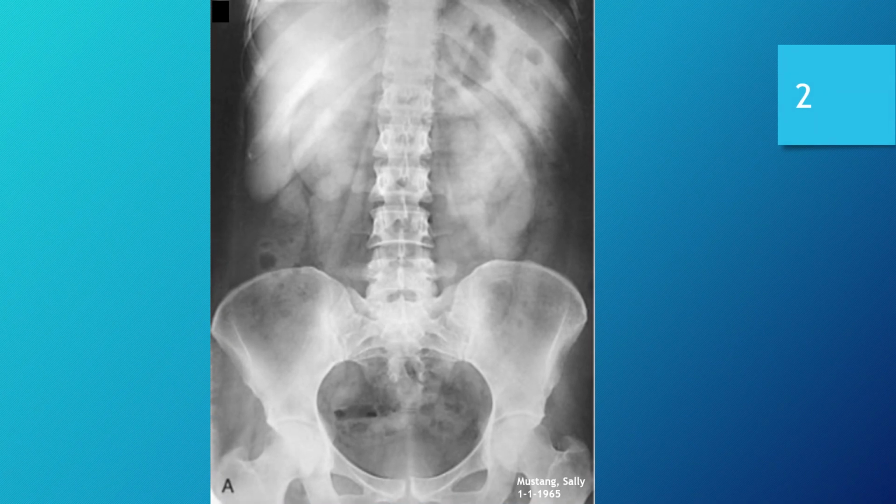All right, here we are. We are into our abdomen images now. We have our first one up here. So just like the chest images, we're going to dive right in. We're going to start at the top and work our way through it. So let's take a look here. All right, number 1 is all required anatomy present in the exam. Yeah, absolutely, it sure is.